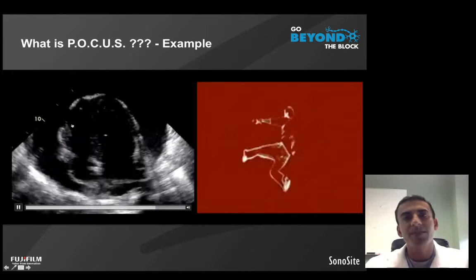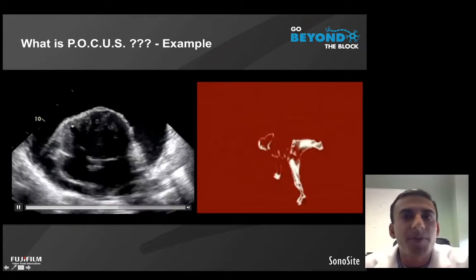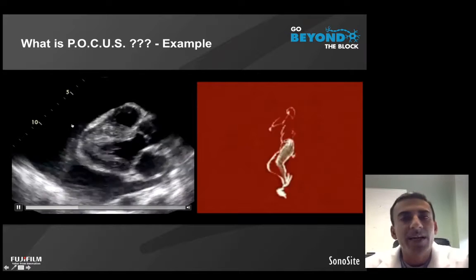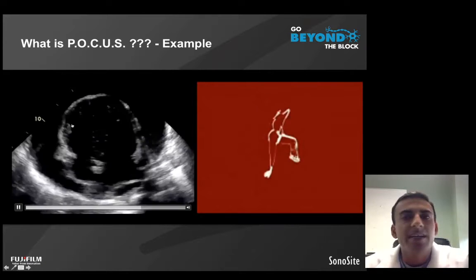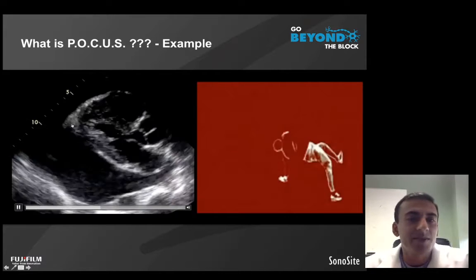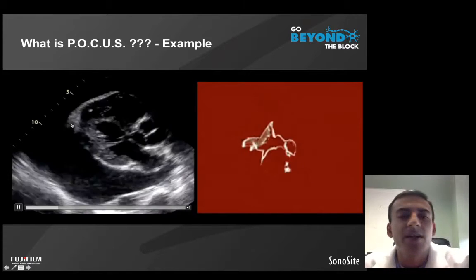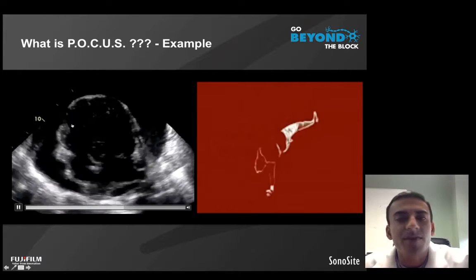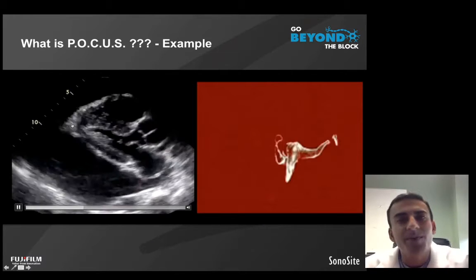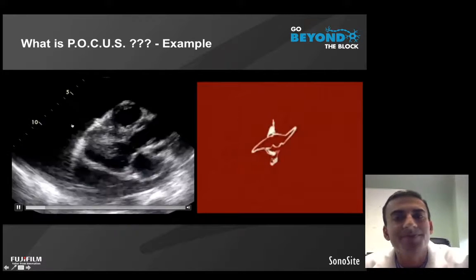Again, using the principles of point-of-care ultrasound, we approached the patient with a well-defined, purposeful examination technique, goal-directed to evaluate an acute situation with the idea of giving answers in real time. And we were able to do that and ultimately have her have the intervention she needed to improve this pathology and then allow her to have her surgical procedure at a later date. But hopefully that highlights one example of how point-of-care ultrasound, particularly in the perioperative setting, could be useful.